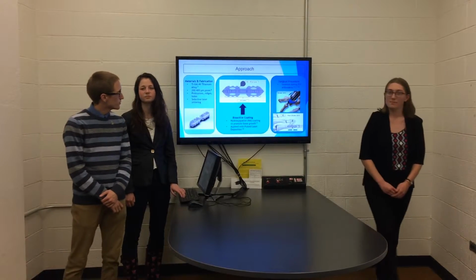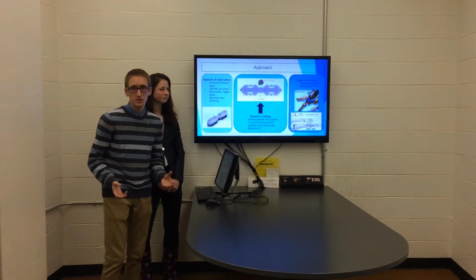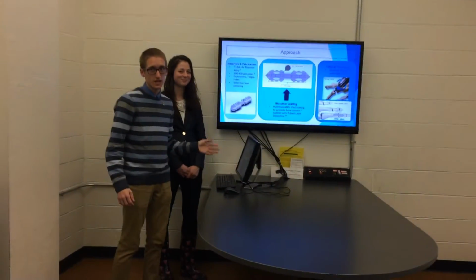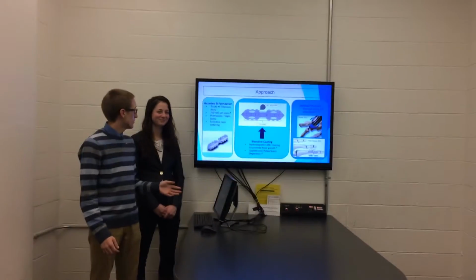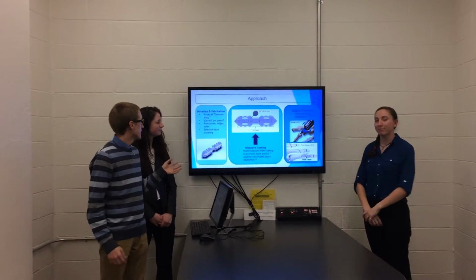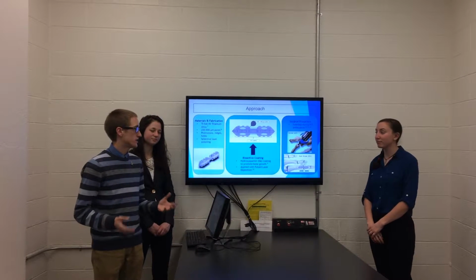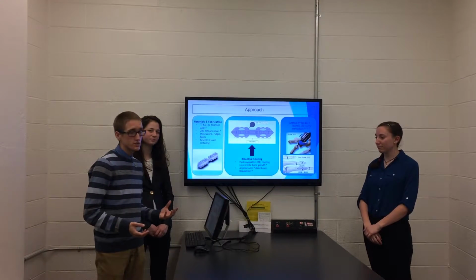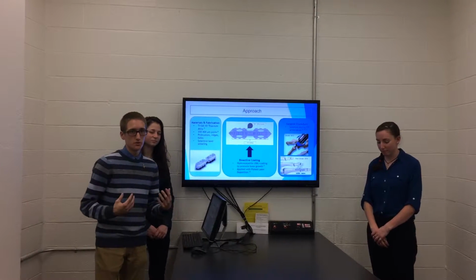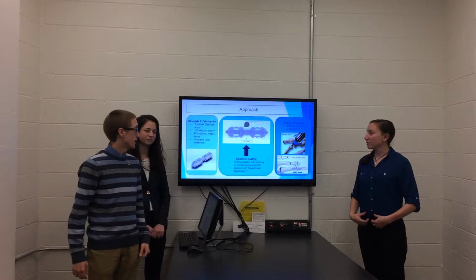So our approach to solving this problem is to be using a one-piece titanium implant for fixation of the bone at the PIP joint. This implant is going to be fabricated using Ti-64 titanium alloy, and it's going to be fabricated using selective laser sintering to create 200 to 400 micrometer sized pores in order to maximize osteocyte ingrowth. In addition to this, it's going to have protrusions, ridges, and holes in multiple planes in order to further increase the surface area in contact with the bone and thus improve anchorage.